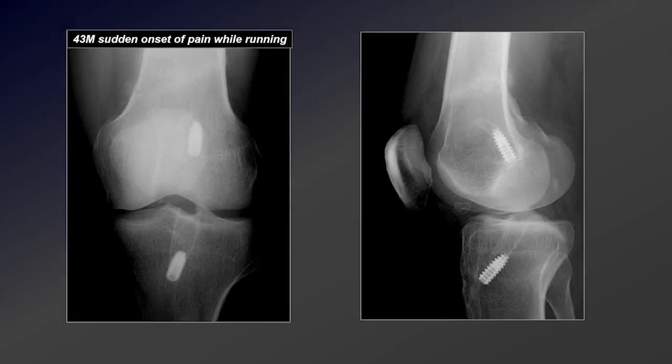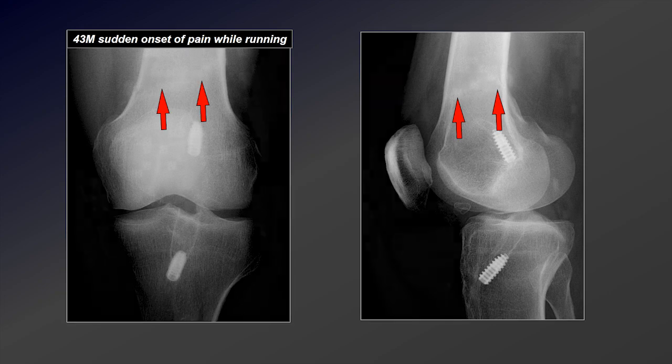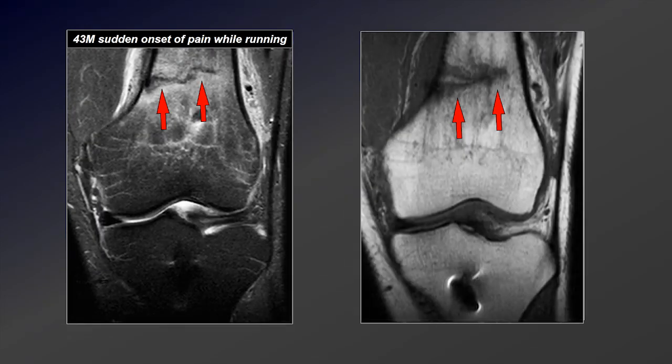Here's another example of a 43-year-old male with sudden onset of pain while running. He's had an ACL reconstruction, and if you look closely in the distal femur, notice that faint sclerotic band going across the distal shaft with some adjacent periosteal reaction — a sign of this stress fracture primarily involving trabecular bone, which is confirmed on the MRI.